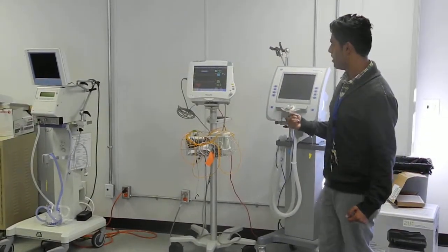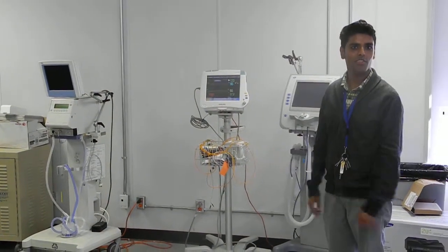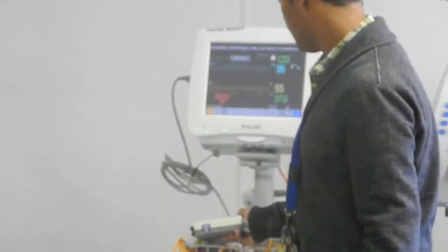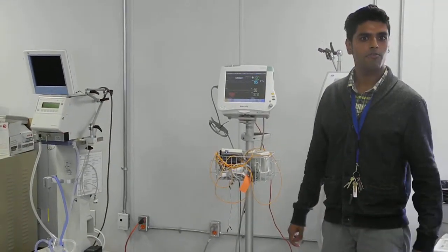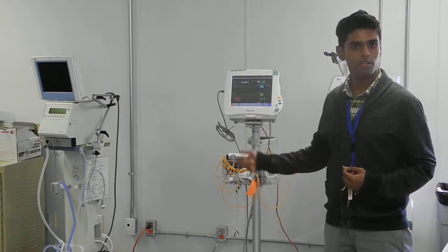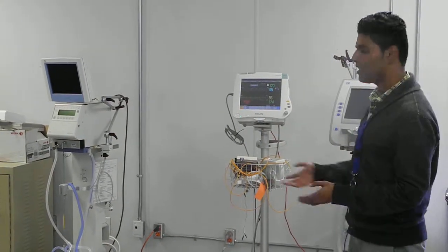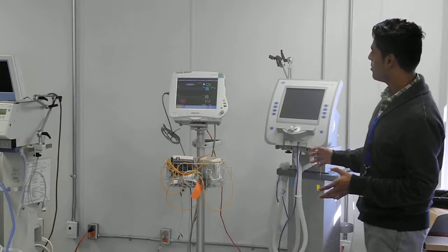So these devices are pretty nifty in that, if I were to hook any of you up, it'll generate signals that are pretty real. But at the same time, we can also hook up these simulators, like this unit over here, which will give you physiological data you can use to run through your algorithms that you've developed, or if you want to test a certain algorithm, you can just pull one of these on and have the monitor pick up that physiological signal, and then we'll send that over to our real-time data analytics system that chugs away, finds out things, and then gives us results about what we saw.